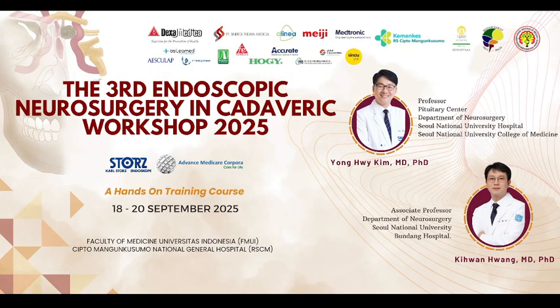This CT image shows the various surgical routes for the transsphenoid approach. The routes are identified by their relationship to the inferior and middle turbinate, as well as the inferior insertion of the superior turbinate. So as you review the OMU CT, you can imagine and estimate where the inferior, middle and superior concha are located. So always keep the deviation and anatomical landmarks in mind before the surgery.